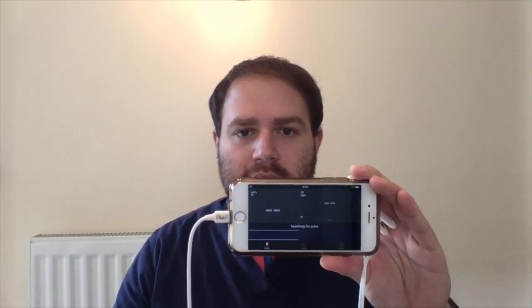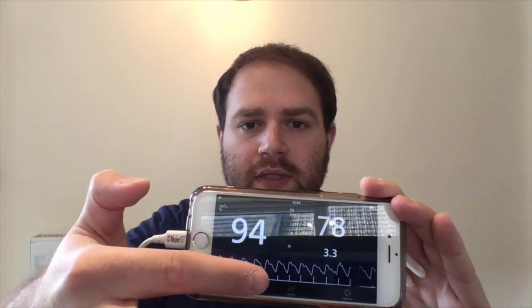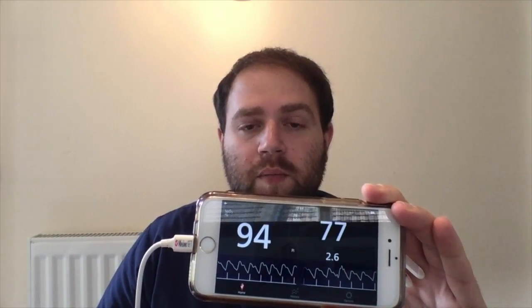It's usually pretty quick on picking up readings. As you can see, we have saturation, we have the pulse rate, we have the perfusion index, and here we have the plethysmographic waveform. The little vertical lines below the waveform are for the SignalIQ technology.